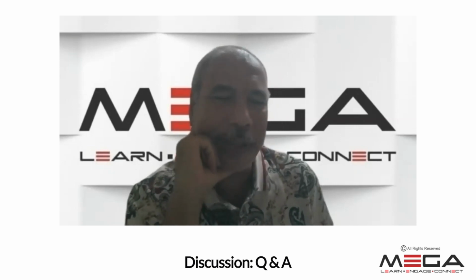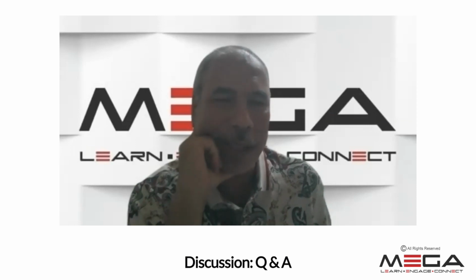But I have one or two questions for Dr. Amr, if you please. When we are using muscle relaxants, usually rocuronium at the induction of anesthesia, and sometimes you need, Dr. Amr, to do the baseline very quickly for the intraoperative neuromonitoring, and you request to reverse the muscle relaxants.